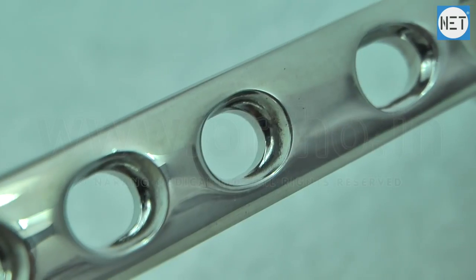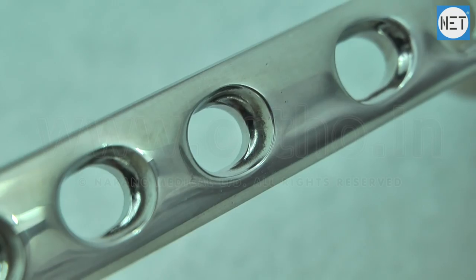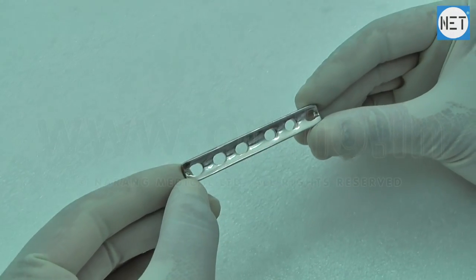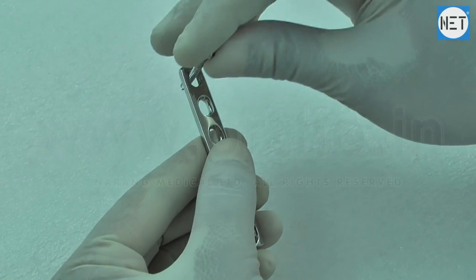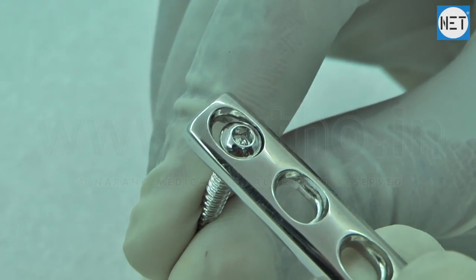The oval-shaped mold is designed to create dynamic pressure between the fractured bone fragments. All holes of the plate allow 3.5 mm cortical and 4 mm cancellous screws.